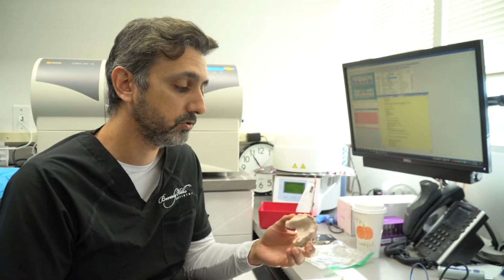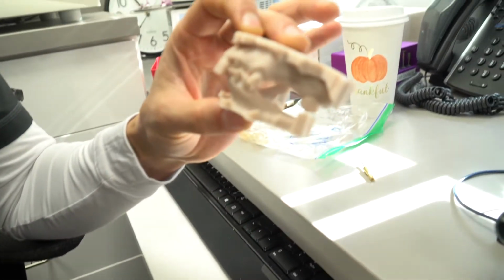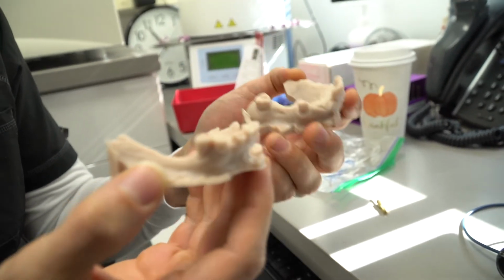This is a patient who over the years has lost several teeth. She's always felt hopeless about her mouth, that it was like, you lose a tooth here, lose a tooth there.